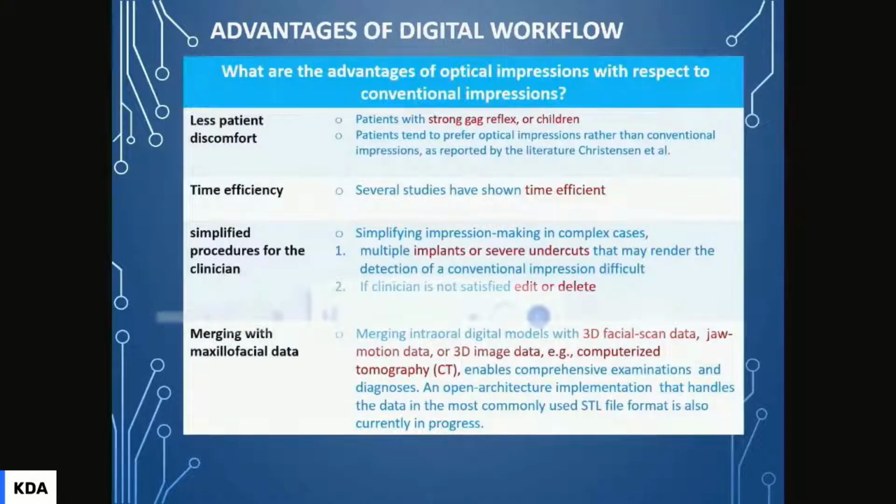So, is there any advantage in using digital workflow in dentistry? Yes. Evidence has shown that patients who have experienced intraoral scanners or digital workflow in general have less gag reflex and less discomfort, because many of them have a gag reflex, especially children. Not only that, it's time efficient, and I will show that later on in my presentation.